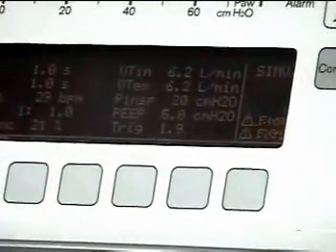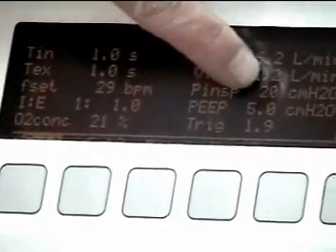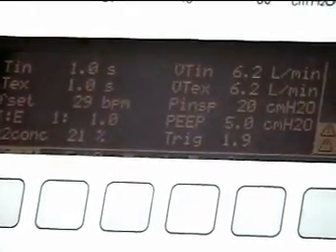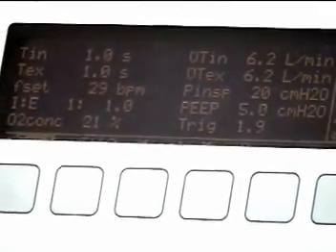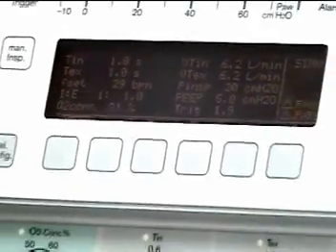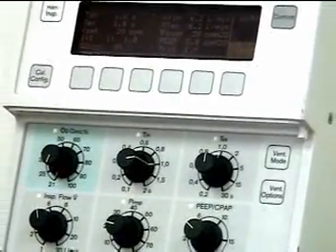I want an inspiratory pressure of 20. I'm going to adjust the inspiratory pressure until I get 20 centimeters of water pressure. At the moment I have a flow of 6 liters per minute.